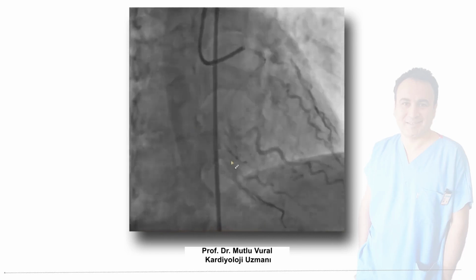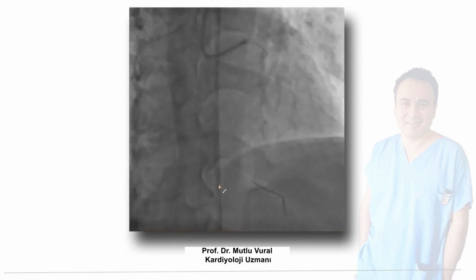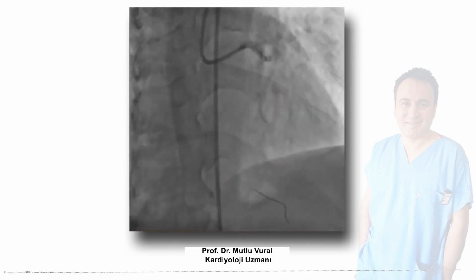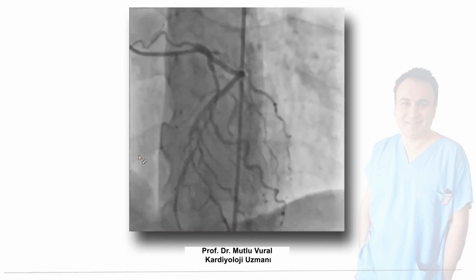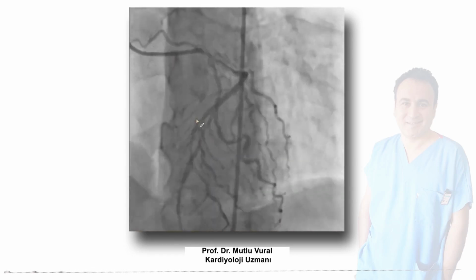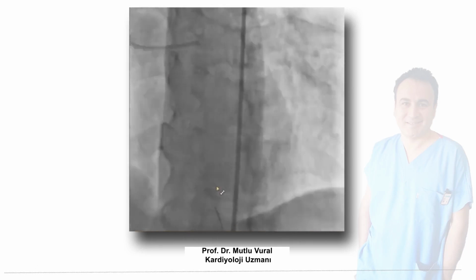There were many branches in that area. We didn't apply a stenting procedure here. It was a tiny branch and overbranching area. We might lose some branches here, and antegrade flow was good.